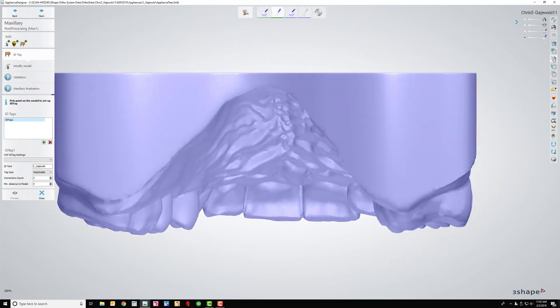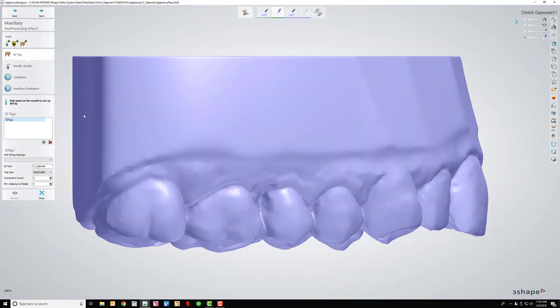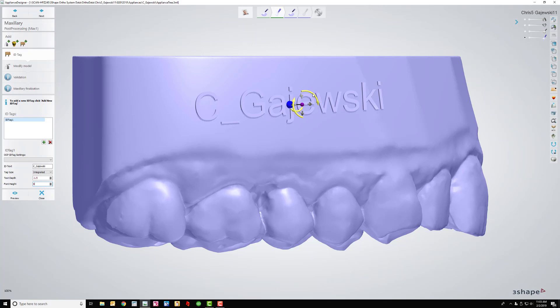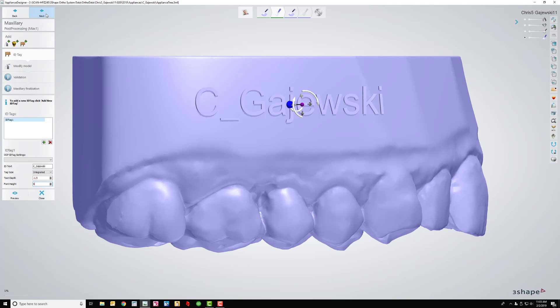And then I've got to come back here because the next thing is adding a name tag. So the ID text is already in there. I switched detachable to integrated. I wish I could figure out how to change these defaults. Text depth, I like negative 1.5, and font height 6 seems to work pretty well for me. And I click here. It pops up. You're never going to get this exact because this thing is just funky. And I typically just do the best that I can and move on. So I just click next.